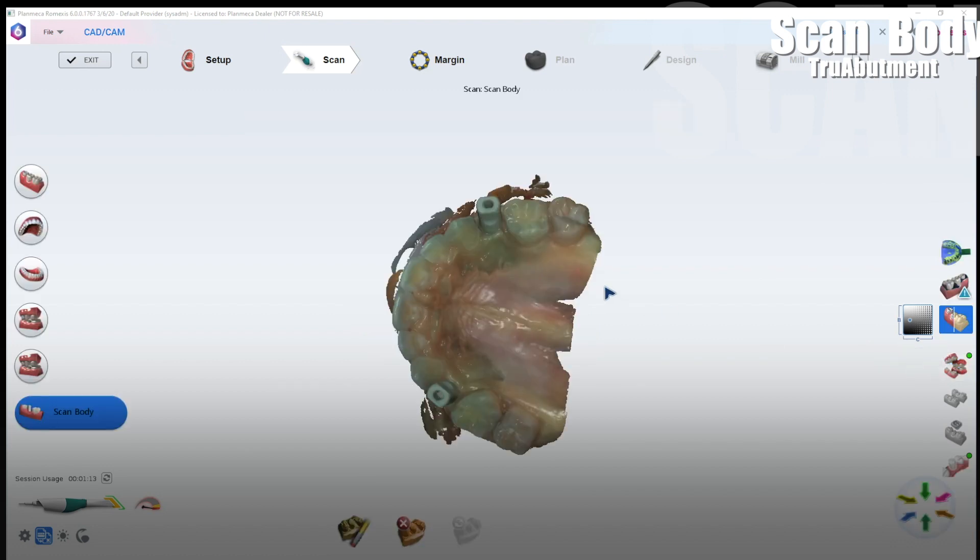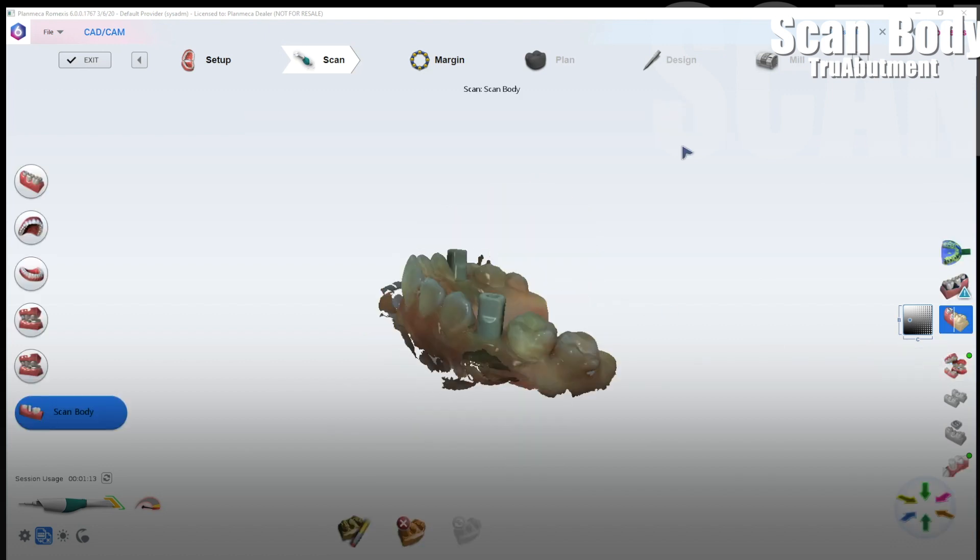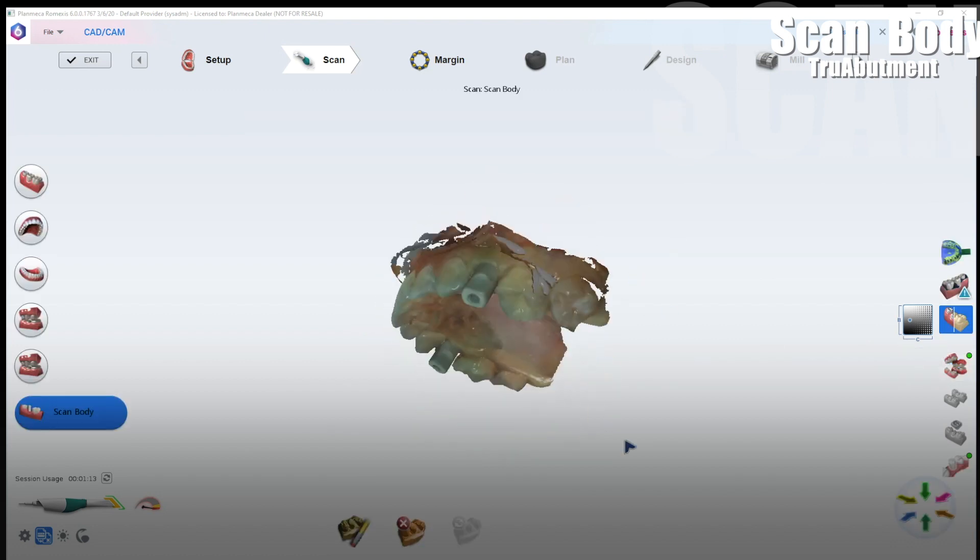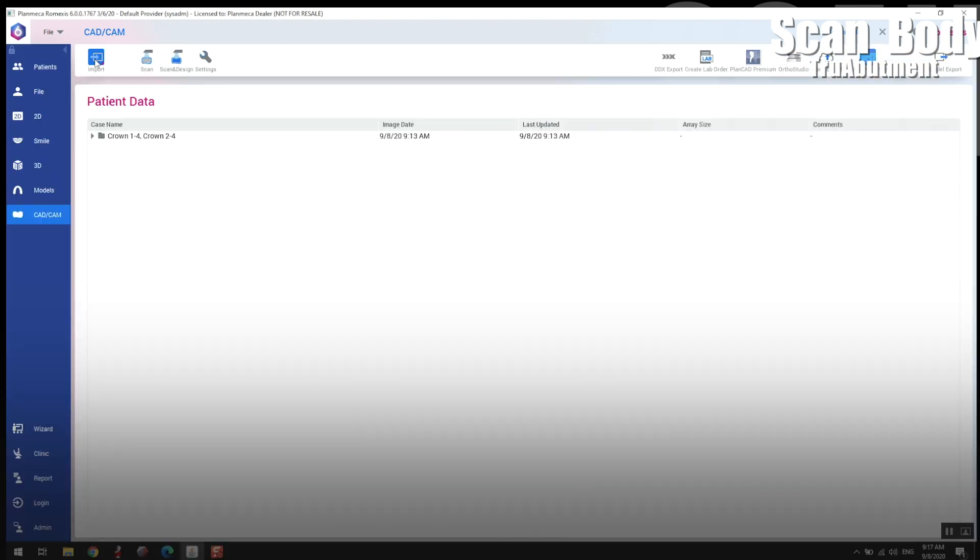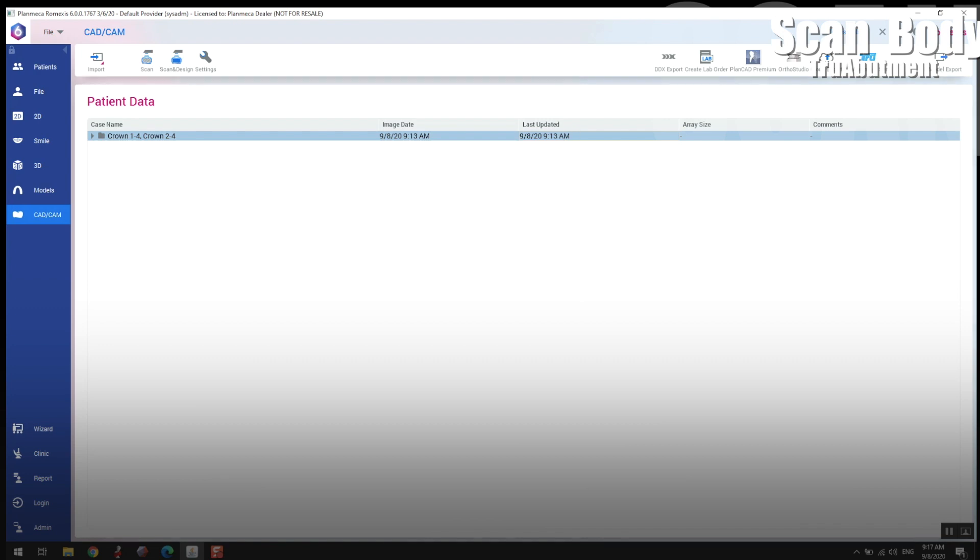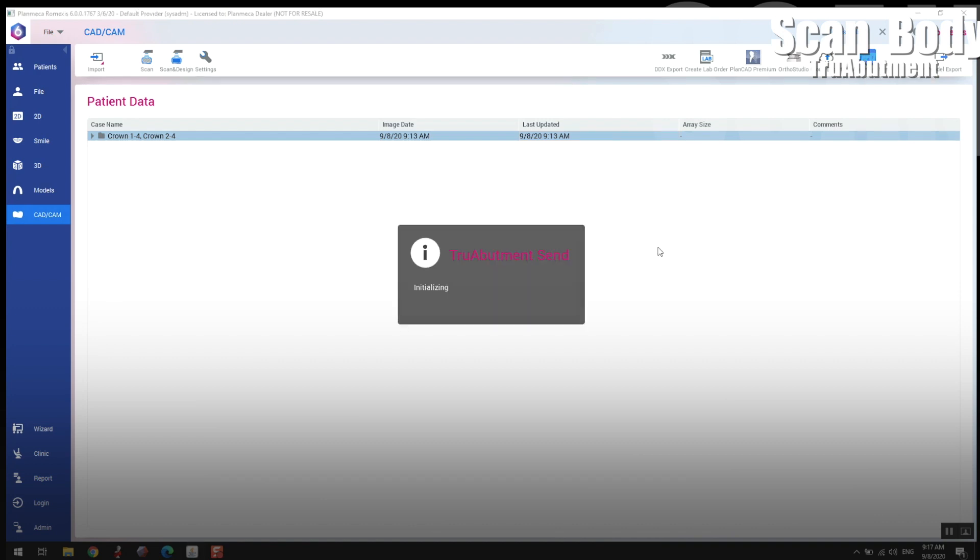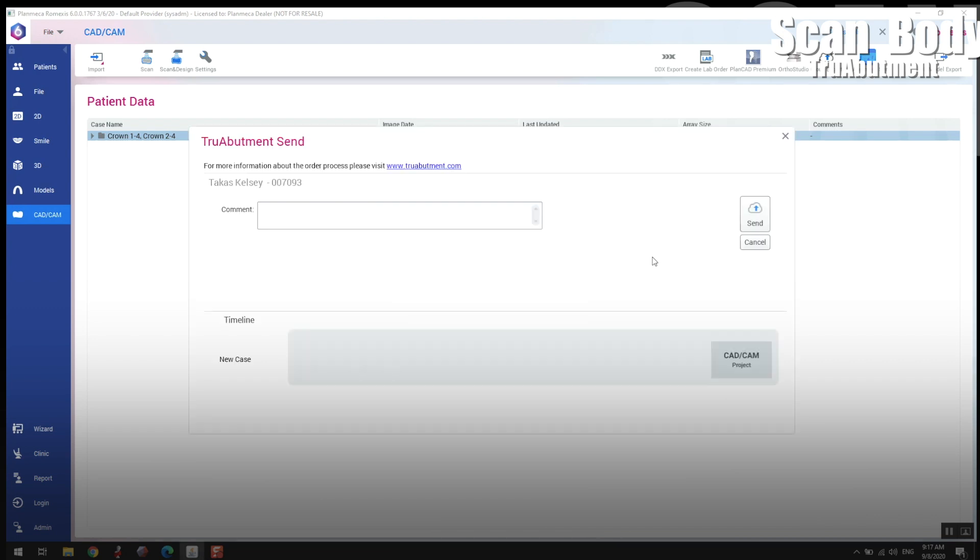We have the scan body scans, soft tissue scans, opposing everything's mounted correctly and so all you do is, you can't see it because I got my labels up there but there's a little True Abutment tab. If you don't have that visible you can go to your administration tab and make sure that that's visible on your Remexis software. But there's a little icon right there you want to pop that and you can fire it off to Remexis cloud or you can just export the STLs or PLY files and fire them off to your lab and whatever HIPAA compliant software that you want to do that.